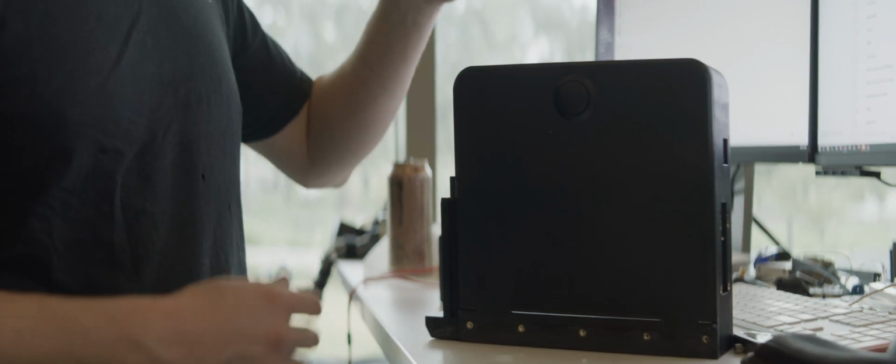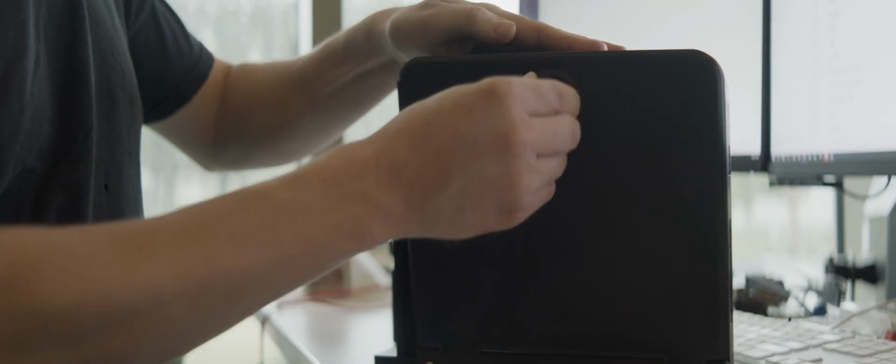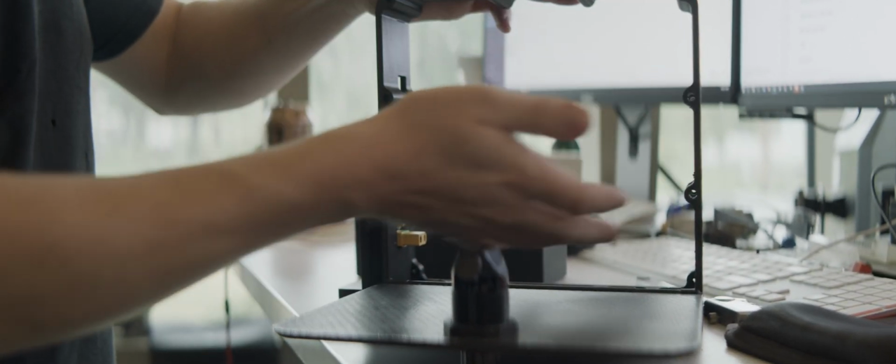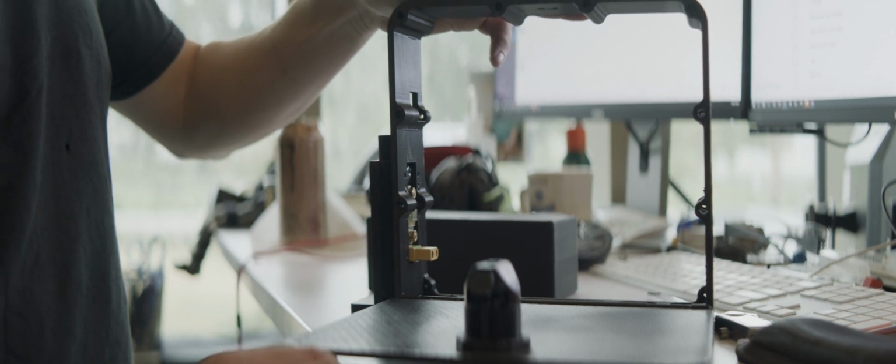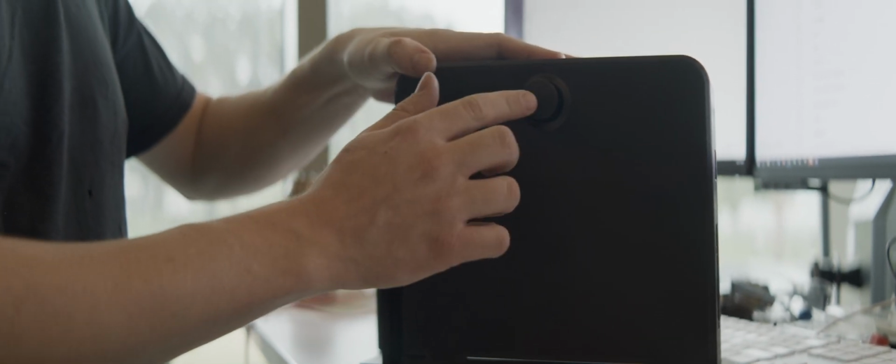So this is the new Quix exoskeleton backpack. It will house the computer electronics. It will have a few status lights to tell us what mode the robot's in. And it will also hold the battery packs here on the sides. And to open it, you release the knob and turn it. That opens it to give access to all of the computer stuff. You just push to close. Push the knob back in so that it's hidden.